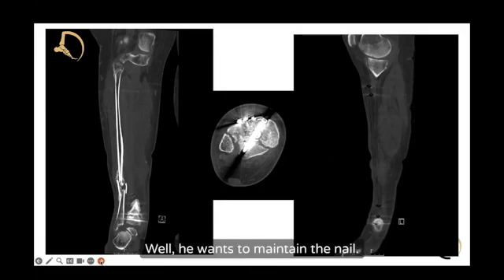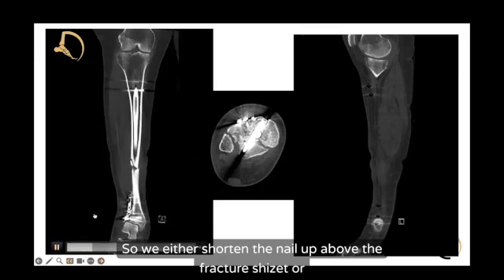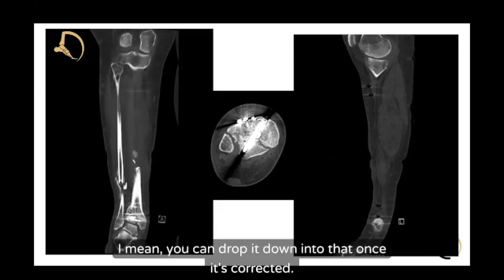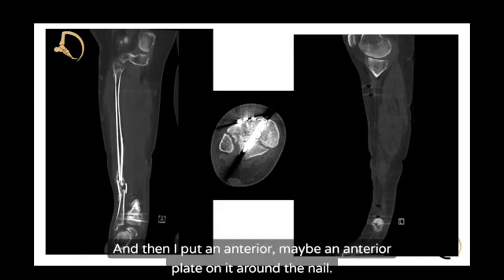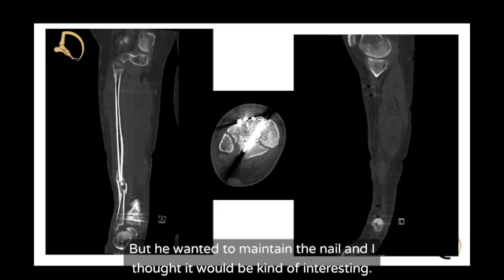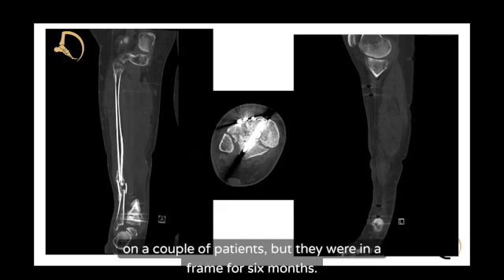The idea is to maintain the existing nail — either shorten it up above the fracture or drop it down into the talus once corrected, and then put an anterior plate on it around the nail. It's been done on a few patients who were in a frame for six months with poor bone quality — the nail was driven down and it wasn't a problem. If you can get an awl in there open, create a pilot hole, then reduce and advance the ball-tip guide rod down into the talus, that could work.